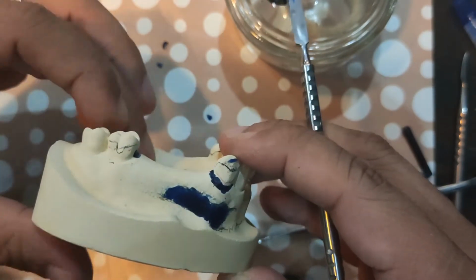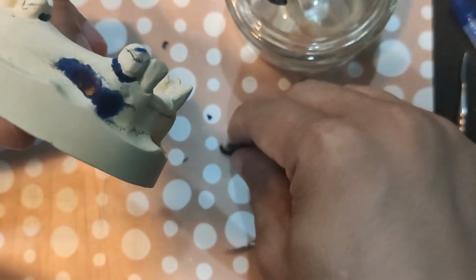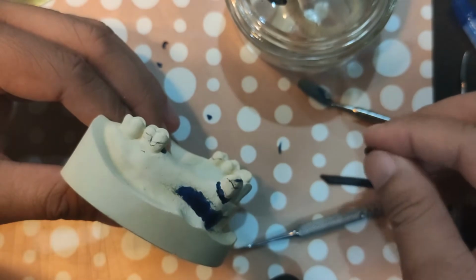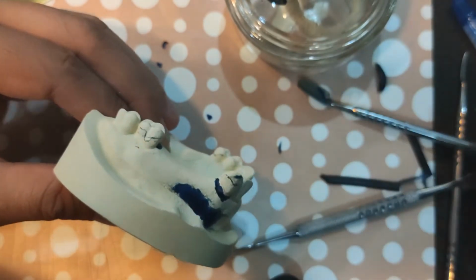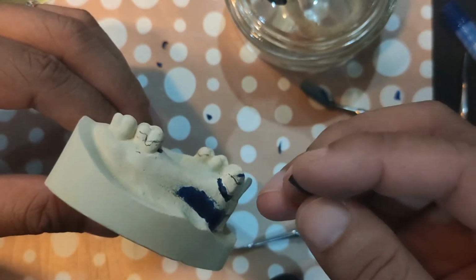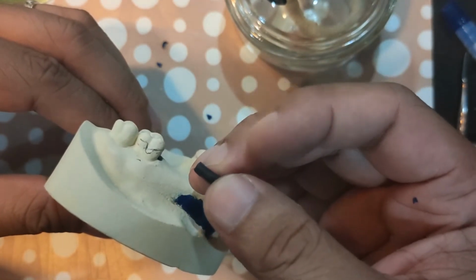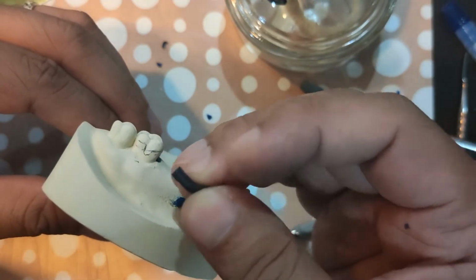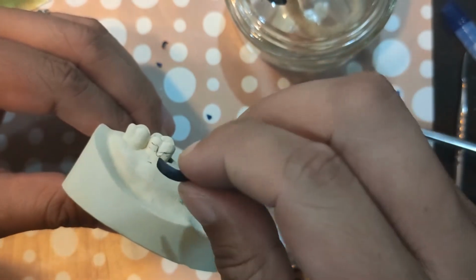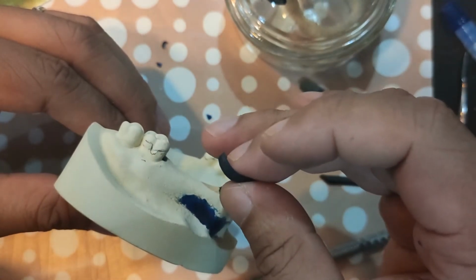Alright. So next is a shape blockout. What you can use is wax. Like I said, you can also use plaster. A little later, maybe I'll show you what a plaster blockout looks like. But for now, para mas mabilis yung demo natin, I can use wax. So I have plenty of half-round, 6 half-round gauge casting wax. What I did was I took a piece and I cut it lengthwise. So I have a ledge immediately.